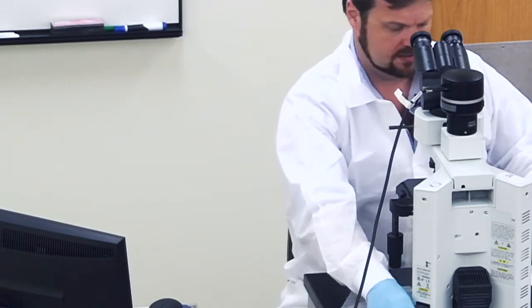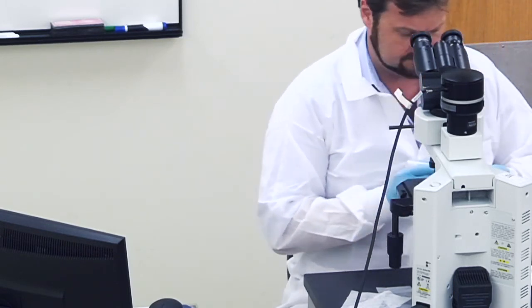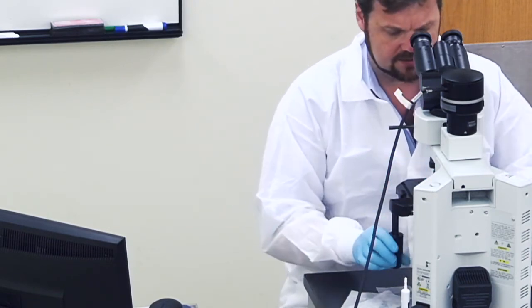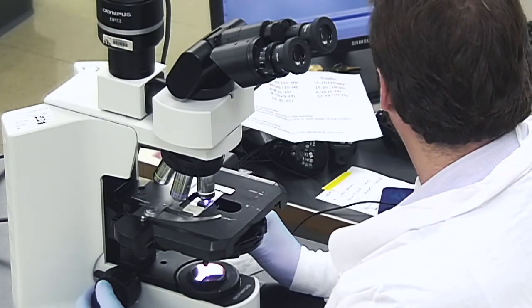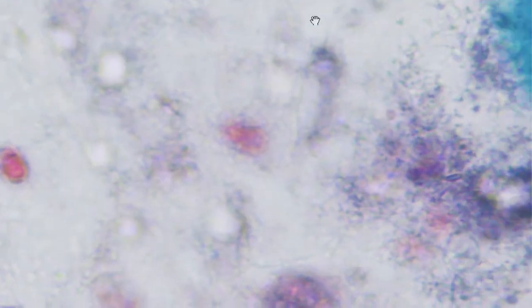One last, and this is one which I only have one slide of. It was given to me by a mentor of mine, Professor John Goldschmied from University of Tasmania. Extremely unusual to come across this, probably because we don't look. Now this is normally found in amongst dental plaque. That's where you tend to find it. We don't think it's actually involved in dental disease. We just think that it likes to hang out in the dental plaque and eat the dying tissue.